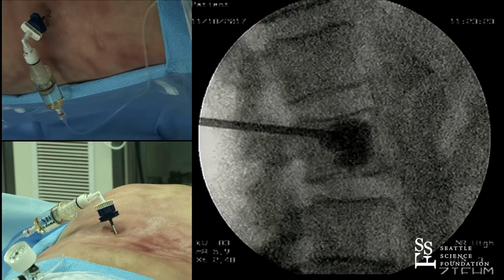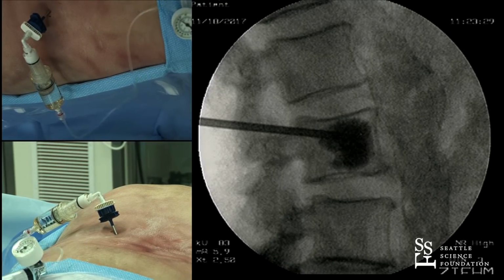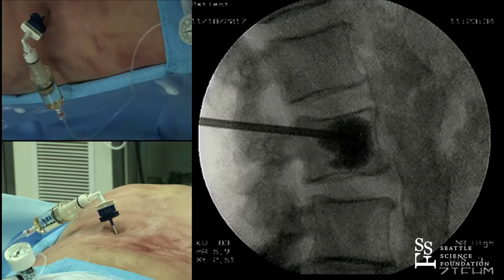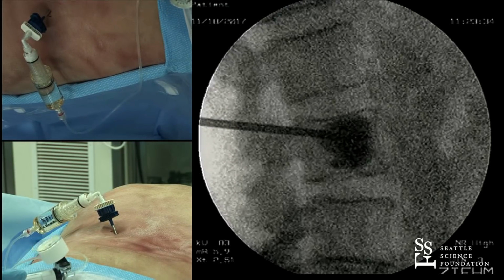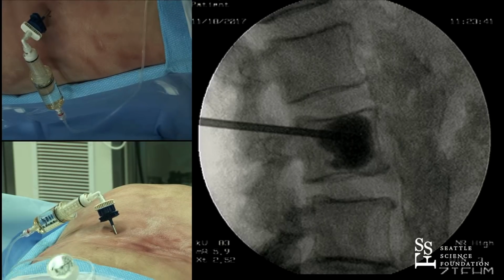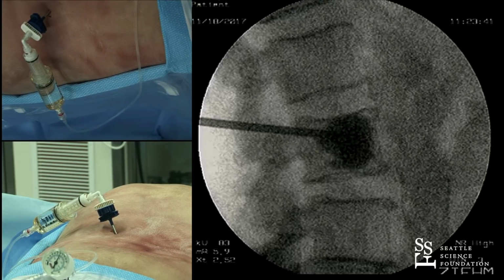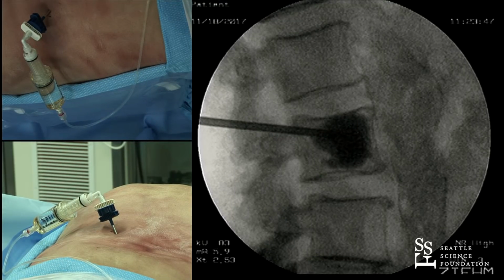It would make things much easier. The reason is that each of the C-arms is $150,000. So from a practical perspective, swinging up and down is what many sites do. Many ambulatory facilities are single C-arm. But they got the Korean ones going. You can go cheap, but you have maintenance problems.